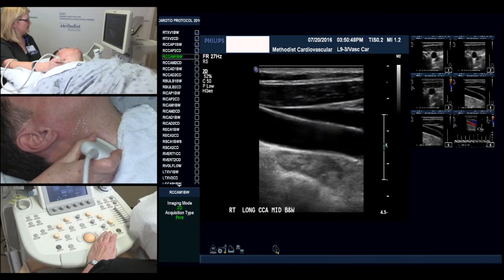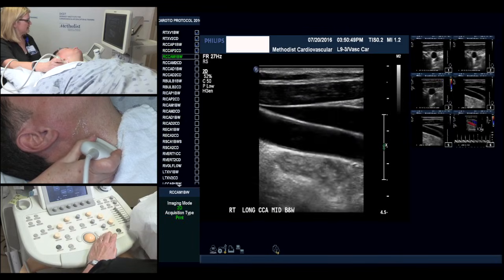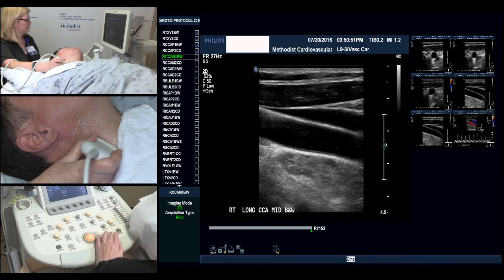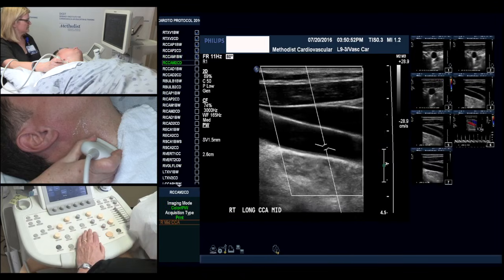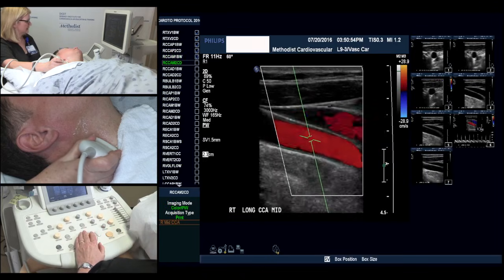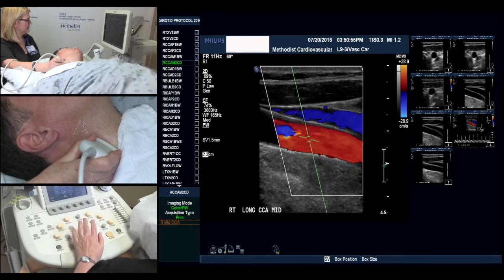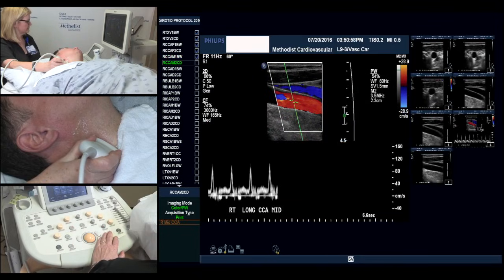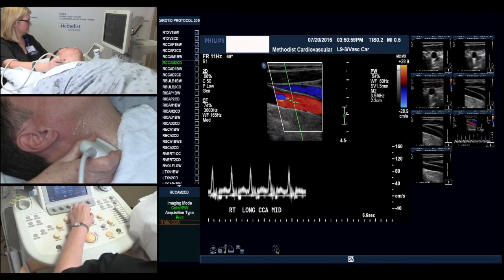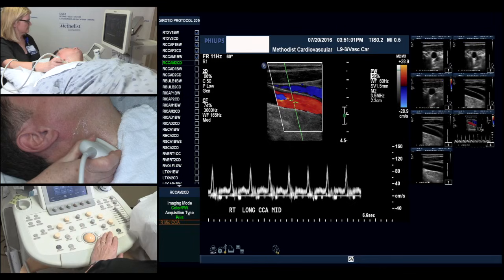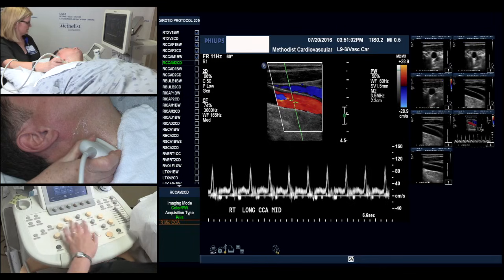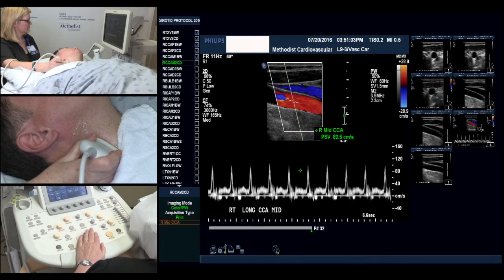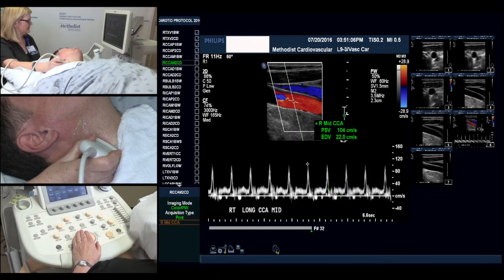Next we'll move to our mid common carotid artery. And again, color and Doppler, obtaining our values for peak systolic and end diastolic velocities.